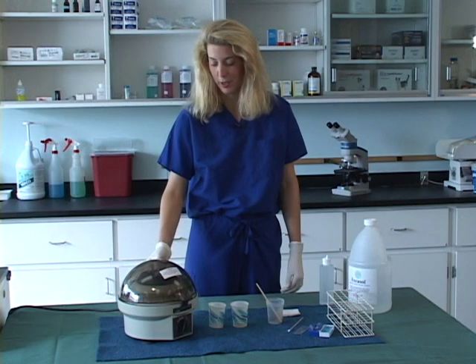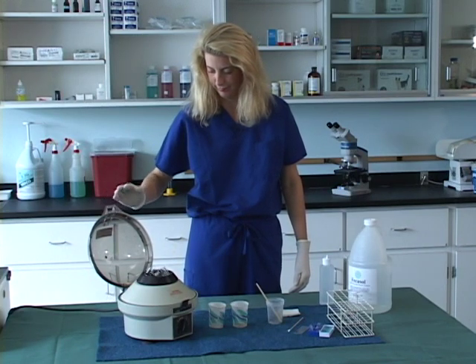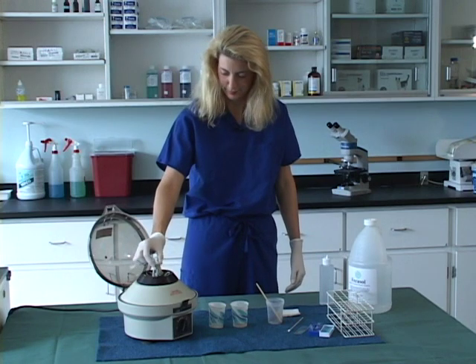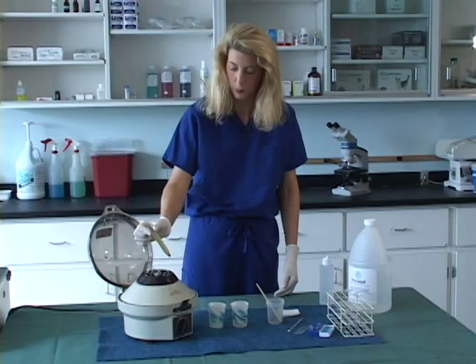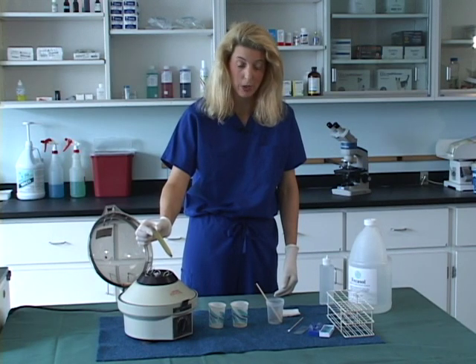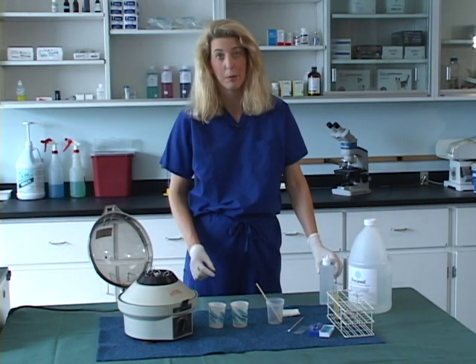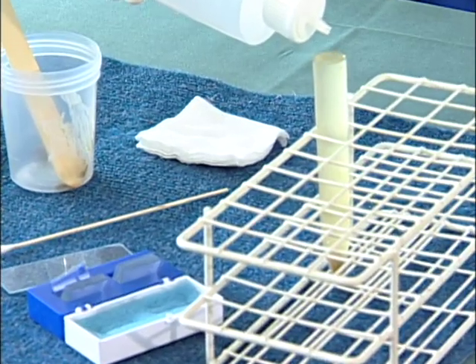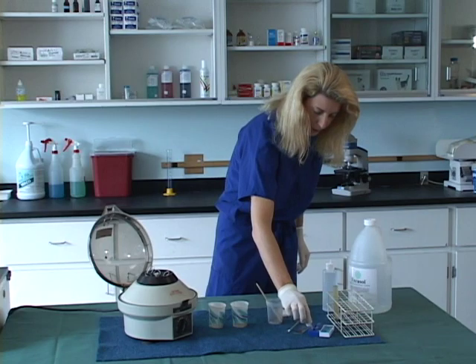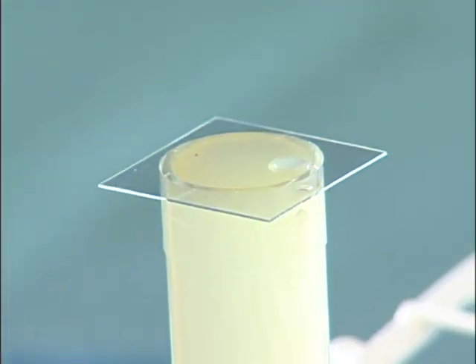Once the centrifuge comes to a complete stop, open the top and remove the fecal conical tube. You will see that the fecal solution has been adequately separated. Place this into the test tube rack. Now we are going to add additional fecal solution to create a meniscus, then add a cover slip to the meniscus and let that stand for 10 minutes. After 10 minutes, we will read the sample by taking the cover slip and placing it on a glass slide.